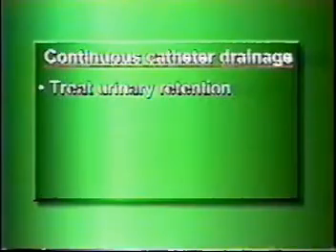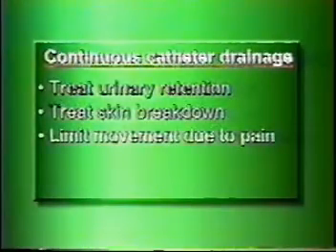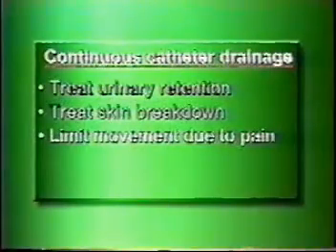This means that the catheter will remain in the bladder and drain the urine through tubing and into a drainage bag. Times that this will happen will be when a person suffers from urinary retention that cannot be surgically corrected, when skin breakdown is caused or irritated by the urinary incontinence, when a terminal illness or severe impairment makes bed and clothing changes uncomfortable or disruptive for the patient. For example, if a person has cancer, frequent repositioning when they're incontinent could be painful and uncomfortable for them.